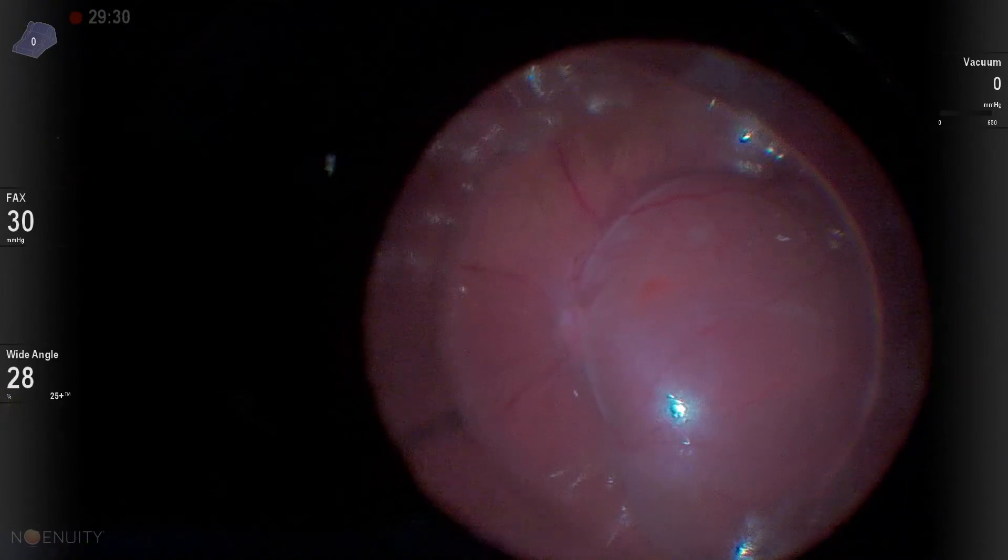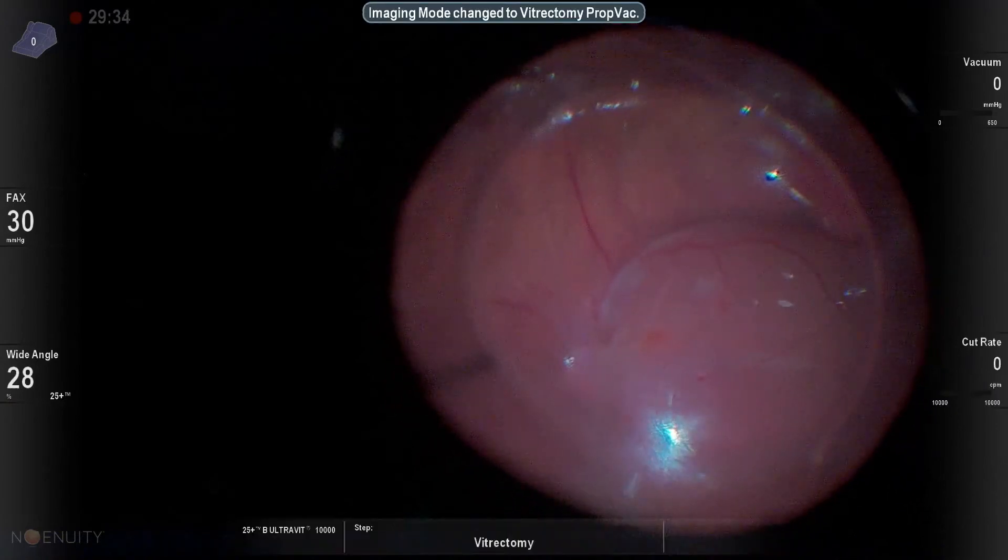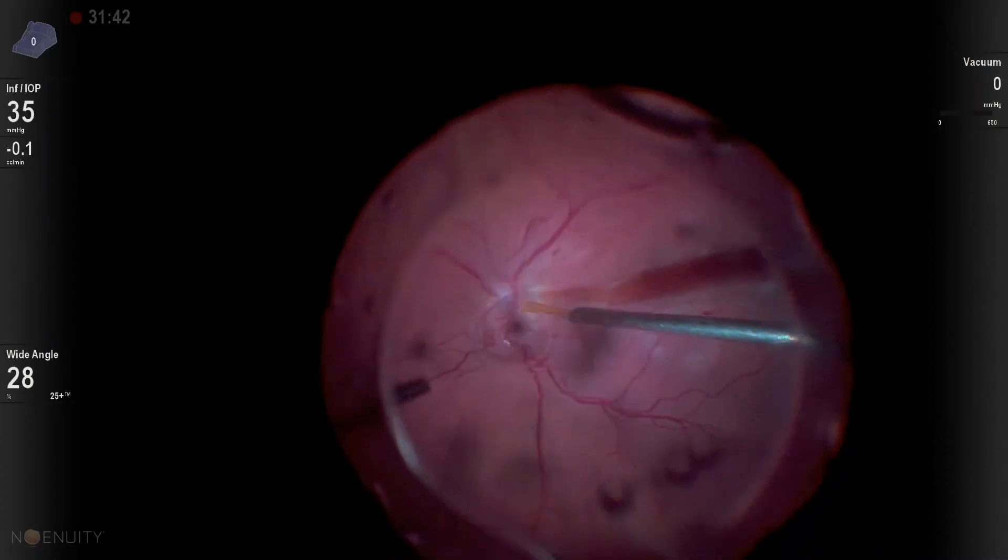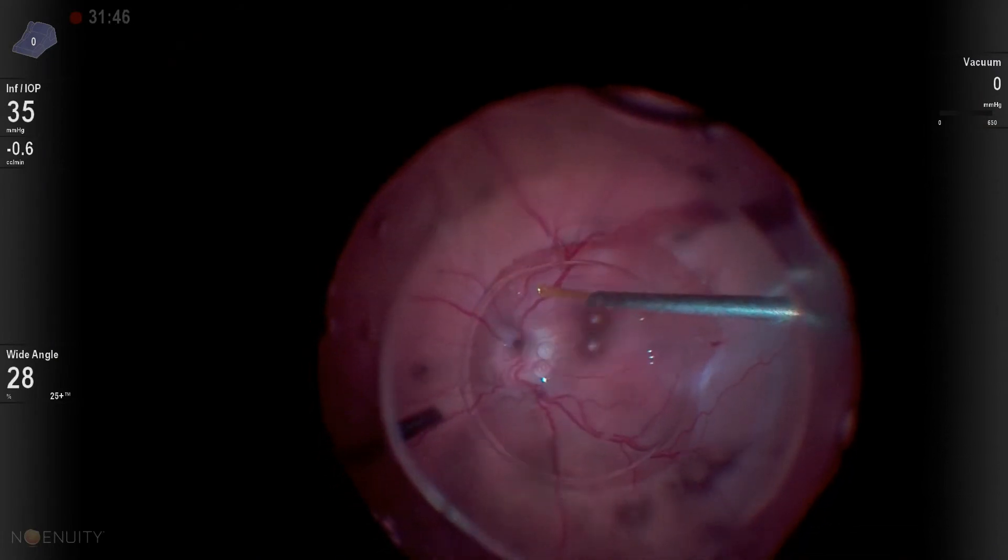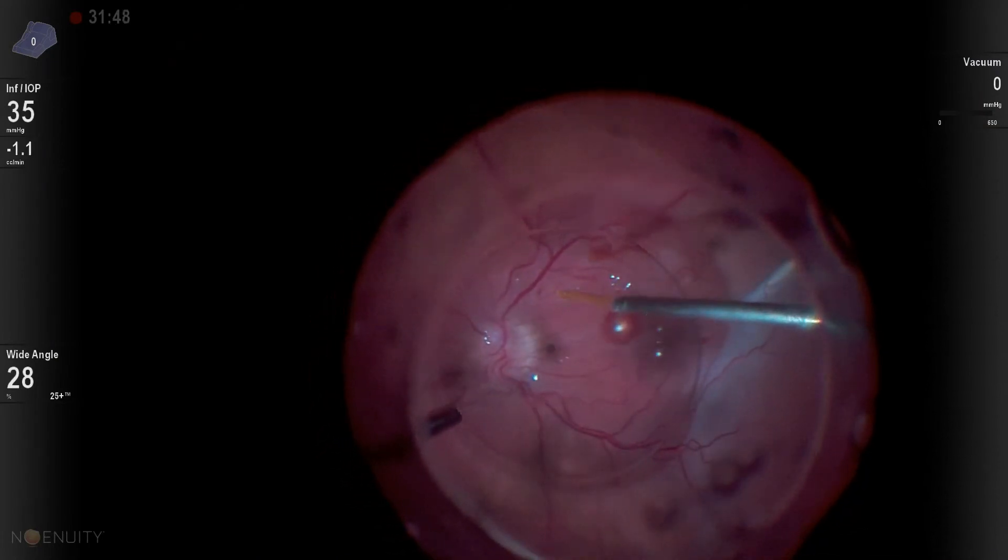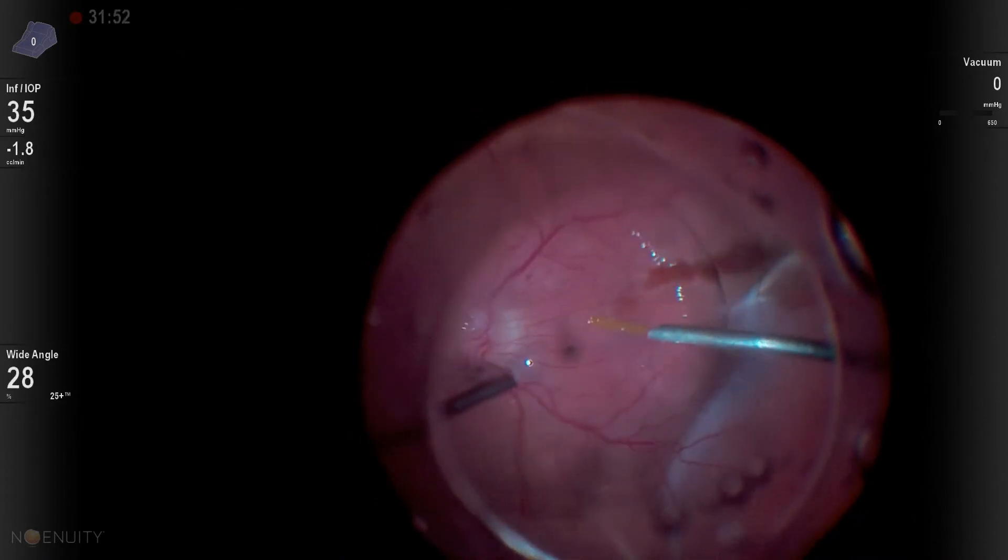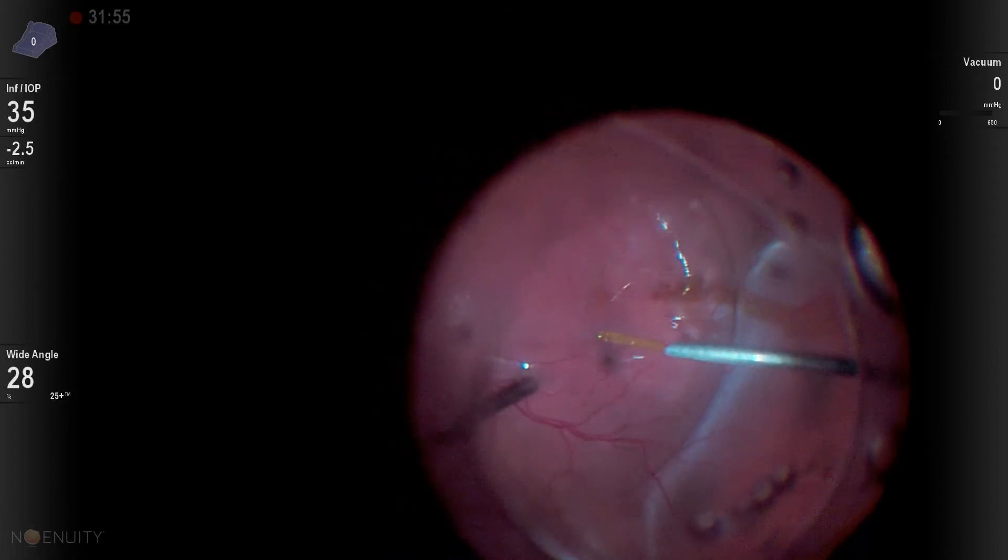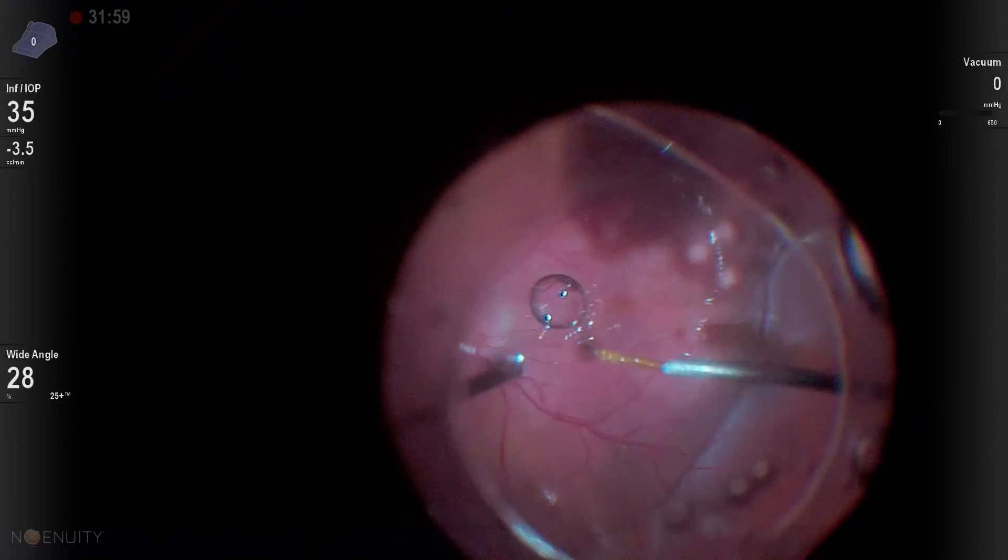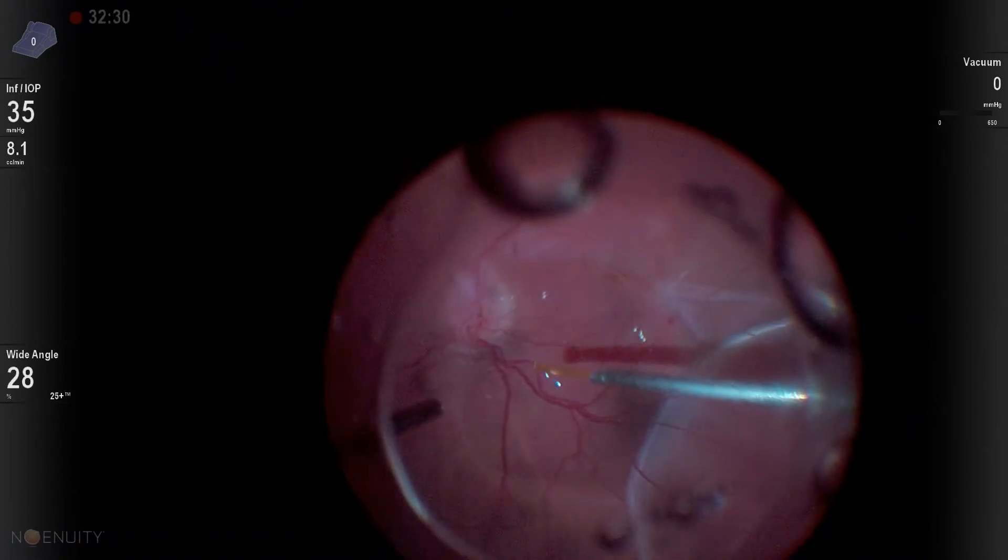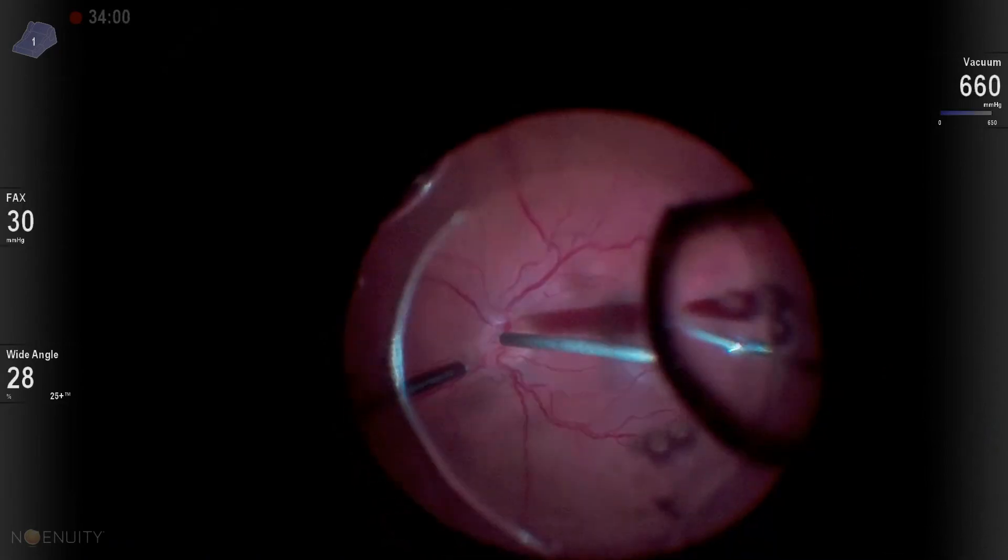But I've only partially peeled the internal limiting membrane. So I really want to finish that ILM peeling. And so we're going to finally go back in and we're going to inject some PFO over this area to push this retina, the subretinal fluid, out towards the periphery. And I had a unique opportunity to talk with several really excellent South American retina specialists, and they do a lot of peeling under PFO. And I learned a lot about how to peel under PFO and things like that.